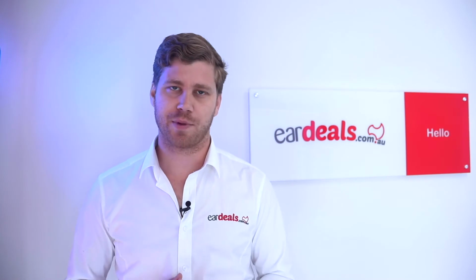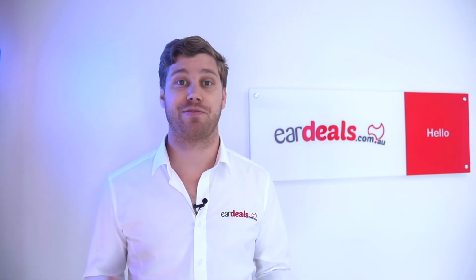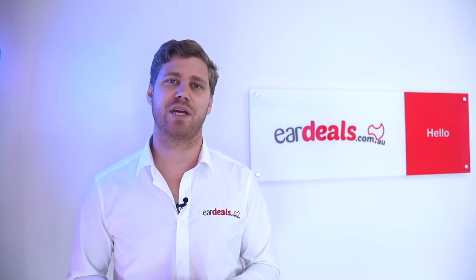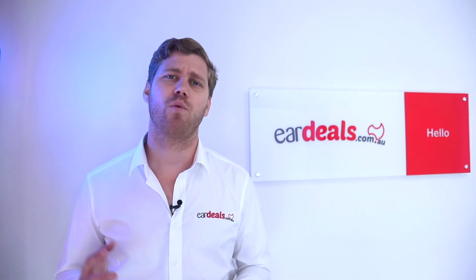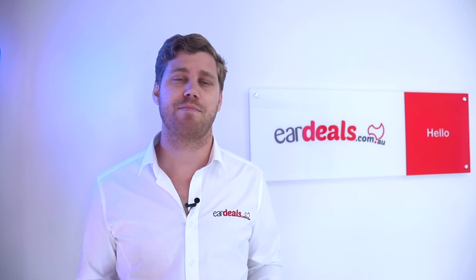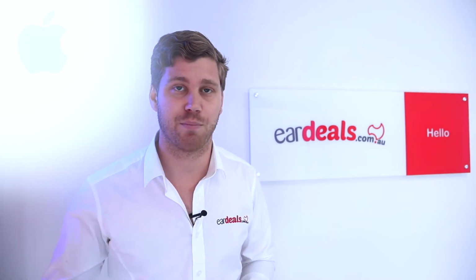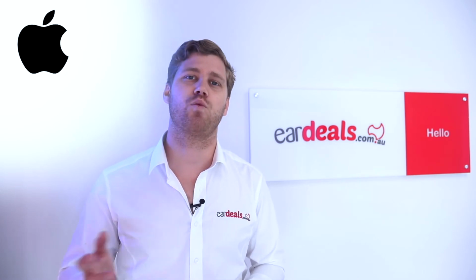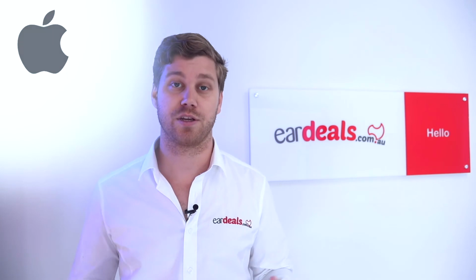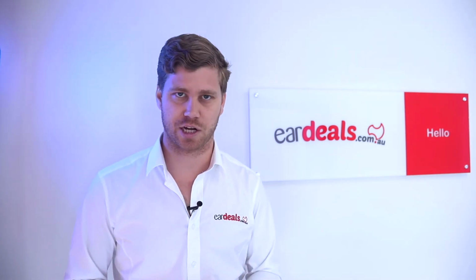Bluetooth technology's come a long way in hearing aids, and Signia, the brand, is no different. However, one key component of Bluetooth technology is how it connects to different devices and what the forms and functions of the Bluetooth capabilities are. Some hearing aid manufacturers only connect directly to, say for instance, Apple devices. And if you want to connect to, say, an Android Bluetooth device wirelessly, you do need an additional device. This is the case with the Signia Charge Go.